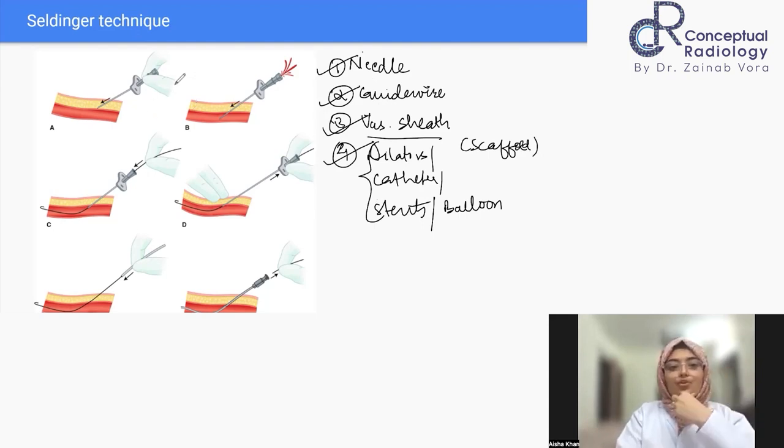So this is my puncture needle. इसको मैं डालती हूँ. Okay, now I have to place it at an angle almost 30 degree to 45 degree depending. अब अगर vein है तो it is going to be superficial structure, so I can have more of an acute angle, say 30 degrees. But if it is a deep lying vessel, such as a deep artery, then I can use as much as 45-degree angle to get access into that particular vessel of interest. So this is with an angle and a puncture needle that I'm going to be puncturing my artery or vein, whichever is the desired vessel.